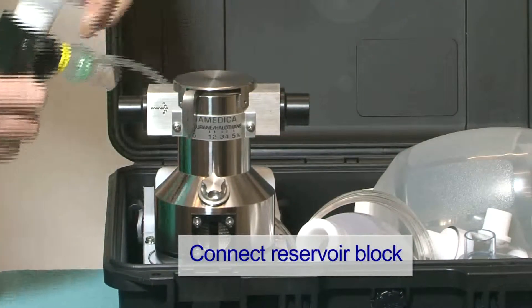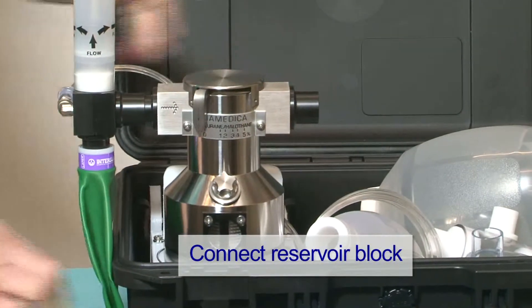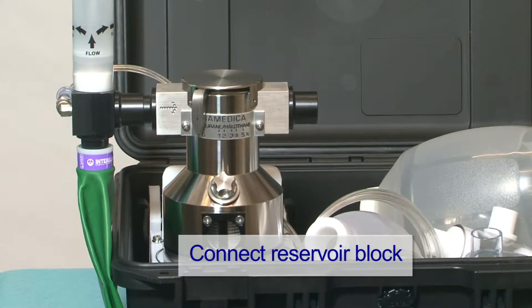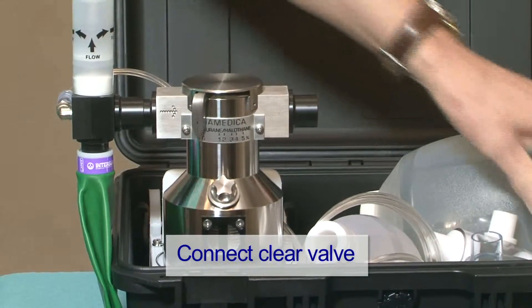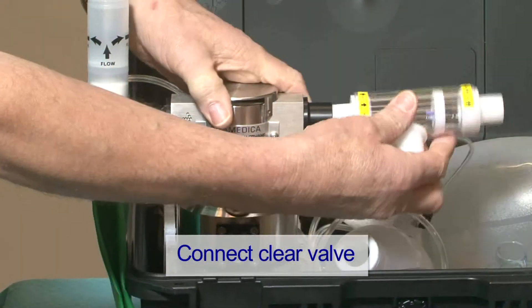Take out the reservoir block and connect it to the vaporizer inlet. Connect the clear section of the valve, ensuring the correct direction of flow.